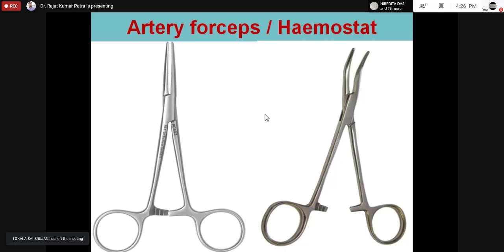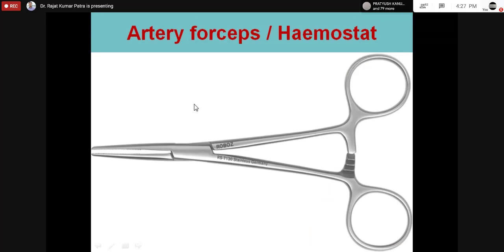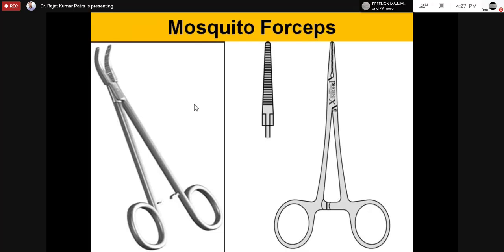By holding the bleeders. So this is straight artery forceps and this is curved artery forceps. There are different types: mosquito, smaller size, medium size, or sometimes larger size. Mainly medium size and mosquito artery forceps will be kept in the exam. So what are the parts again? These are the ring, the ratchet, the body, the joint. This is also artery forceps, straight, larger size. This is mosquito, smaller size, and you see the serrations are horizontal. These are mosquito forceps.